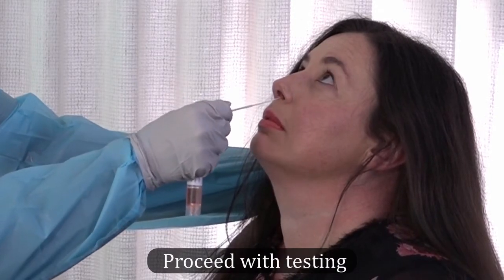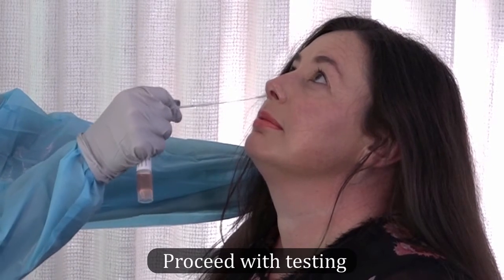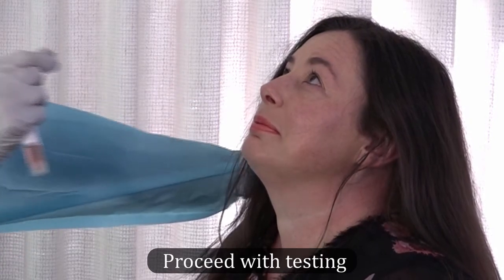While gently rotating the swab, insert the swab less than one inch, about two centimeters, into the nostril until resistance is met at the turbinates. Rotate the swab several times against the nasal wall and repeat the process in the other nostril using the same swab.